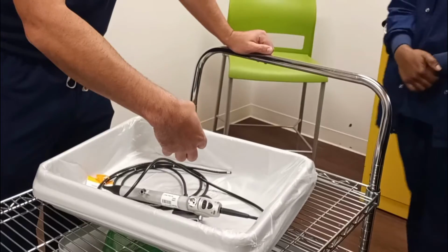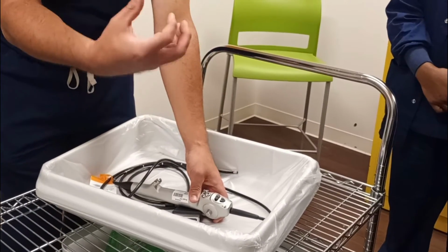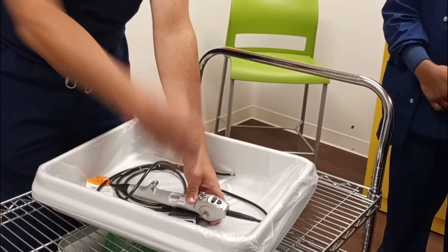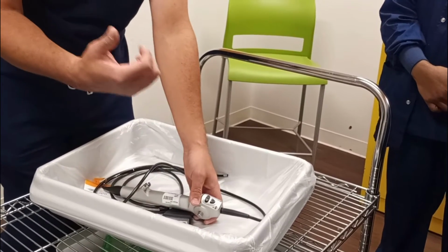That can't go in the water. Okay. All right. No, it's a good question. So the actual hand tester that you have in your hand cannot go in the water. This with the leak tester attached can go in the water.